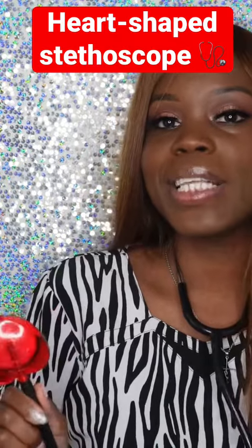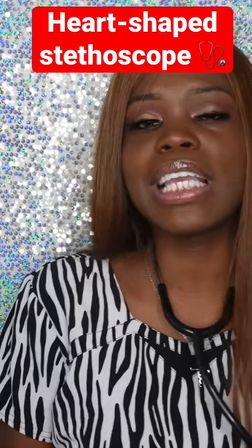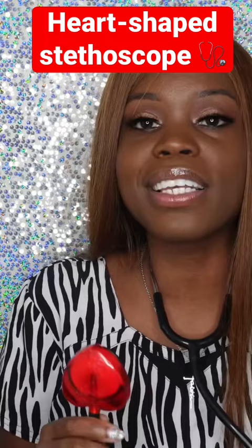This heart-shaped stethoscope is one that I think every medical assistant should have, especially if you're working in pediatrics. Kids tend to be nervous when they come in, so when you have cute scrubs and a stethoscope like this, it tends to relax them because then they want to play with it.